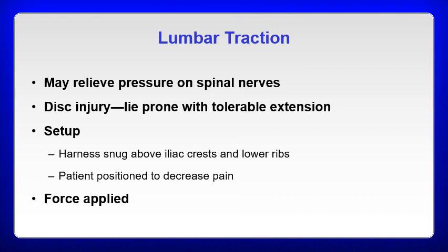Same thing for overall treatment time. So treatment time, again, here can be 10 to 30 minutes. I would start with the least amount of time and see how they respond. If they respond well to 10 minutes of treatment, then I would stay there for a little bit. You can actually cause more problems by allowing traction to be done for too long a period of time.